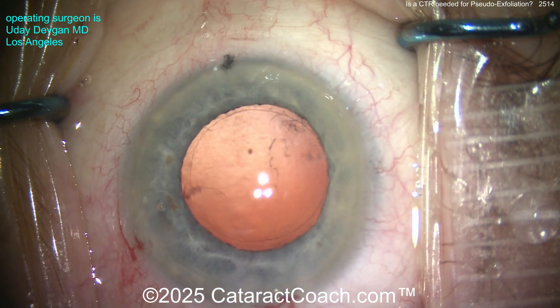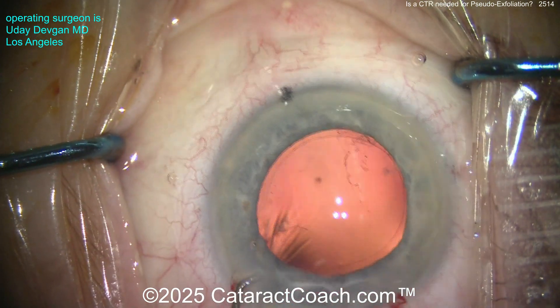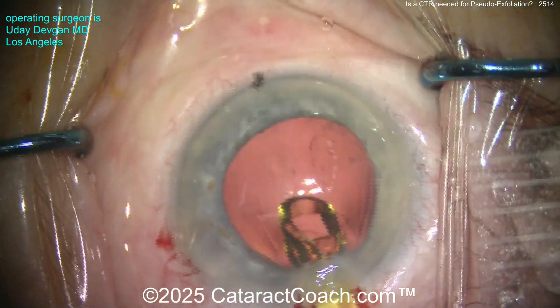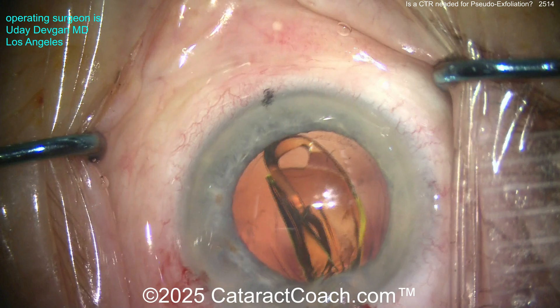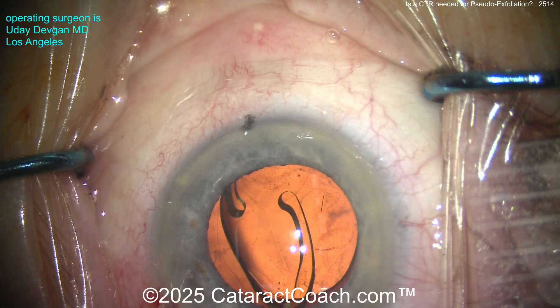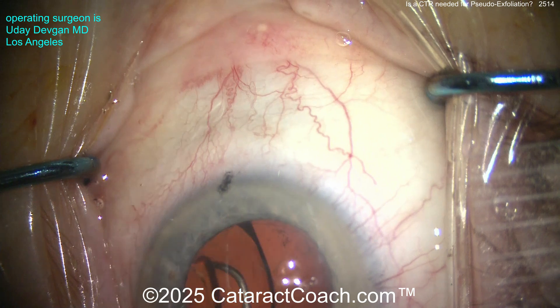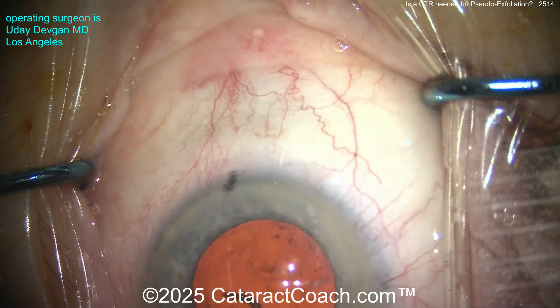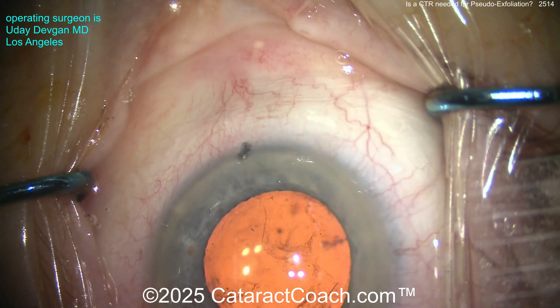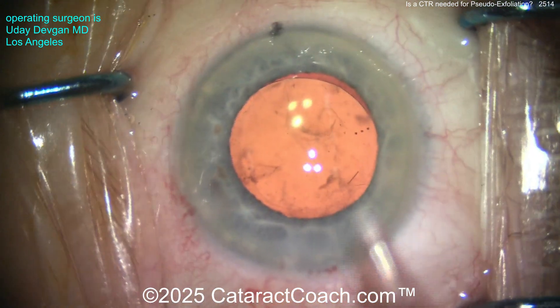This patient is getting a monofocal toric lens. This is an average eye — IOL power is about 20 diopters. So — to answer the question posed at the very beginning: do you need a CTR in every case of pseudo-exfoliation? I say no, and I don't put one in routinely. If I'm doing the case and I find zonular weakness, then there's an upside to putting in the CTR — it can support those focal weak areas, and also help balance out later capsular contraction and phimosis.